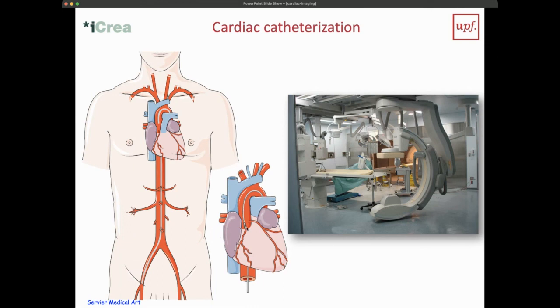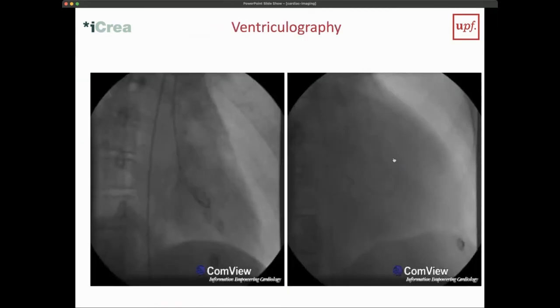And then we can even selectively enter this catheter in the beginning, what we call the ostium of a coronary artery, and immediately inject contrast agent there. And then we can do imaging directly with the fluoroscopy, as we have been saying. So we have an X-ray source and we have a detector, and we can do real-time imaging there.